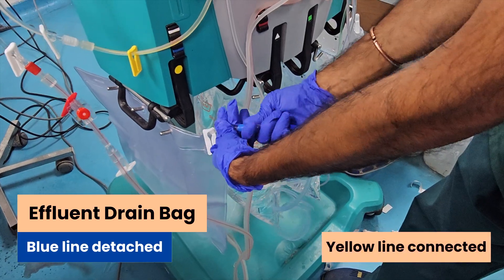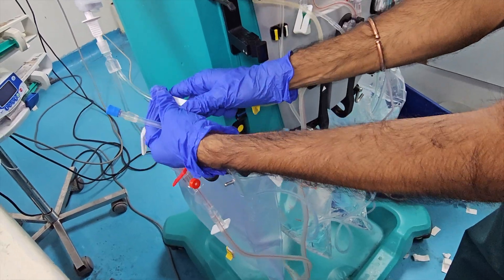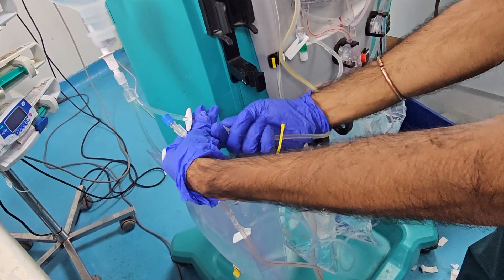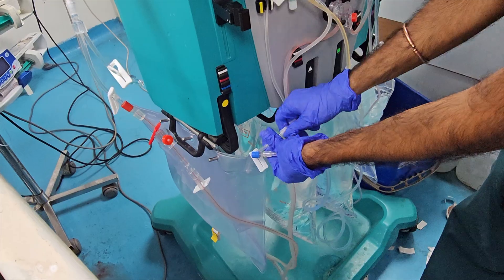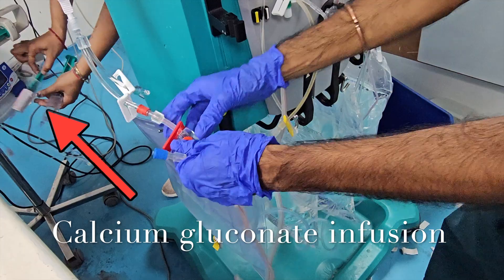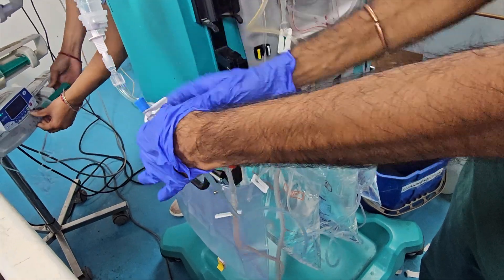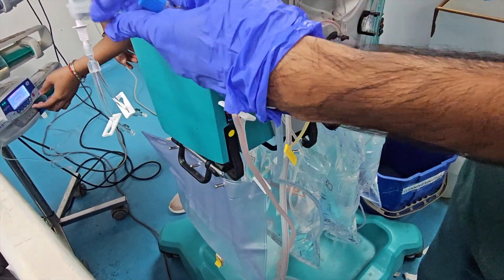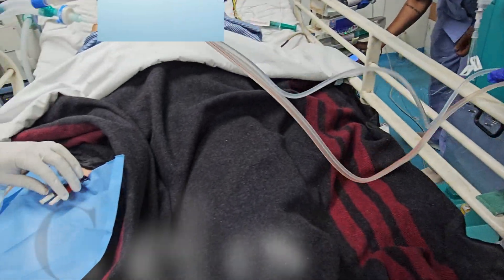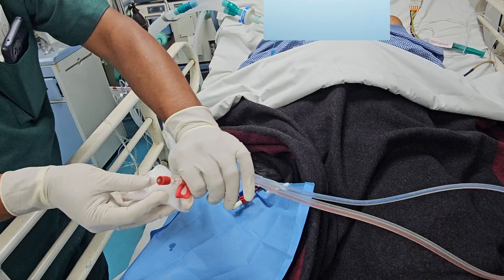Blue line removed from the effluent bag. Yellow line connected in its place. Calcium gluconate infusion started, as we are using citrate anticoagulation.